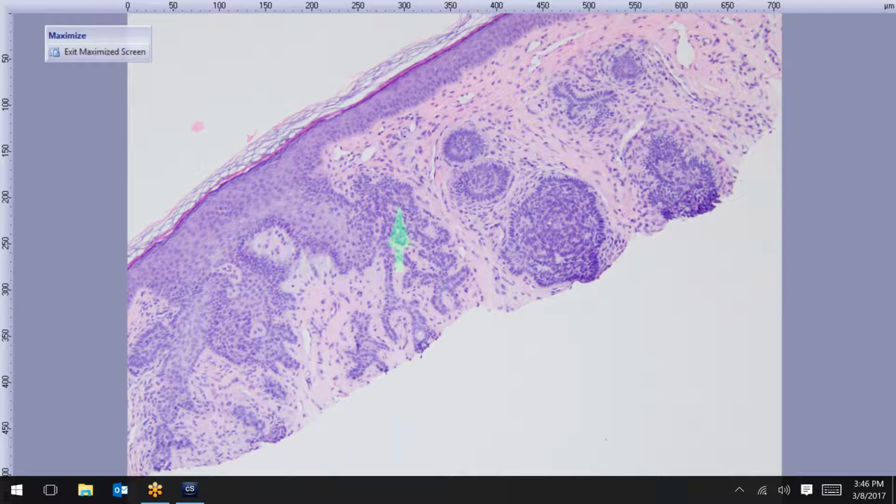Now, this one, I will say, is a little bit different from the typical BCC. First off, you'll see that these lobules here are reticulated and basaloid, but BCCs can do that as well, so that's not enough. The other thing that we're missing here that BCCs have is a good retraction artifact, and in fact quite the opposite. In BCC you get this fibromucinous stroma with retraction artifact, but here it's really fibrotic. As we look in between these little blue islands, there's fibroplasia.